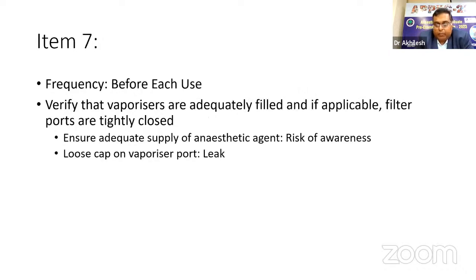Then verify the vaporizers are adequately filled and filter ports are tightly closed. One of the most common causes of leak in the machine is the vaporizer area. So ensure an adequate supply of anesthetic agent, and a loose cap on a vaporizer port can lead to leakage.